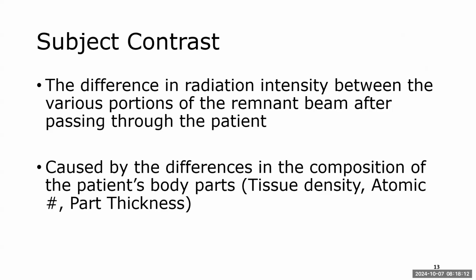So let's talk about a couple of words in that definition to make sure that everybody sort of follows what that's saying. So what did we say the word intensity means in radiology terms? What is intensity referring to? Quantity, amount, how many, right? How many photons, okay? So we're talking about the difference in quantity between the various portions of the remnant beam.